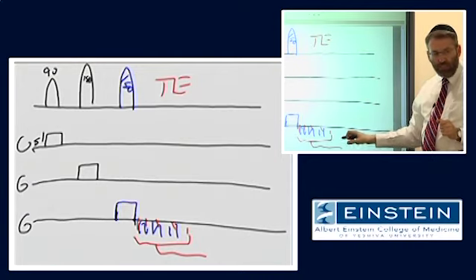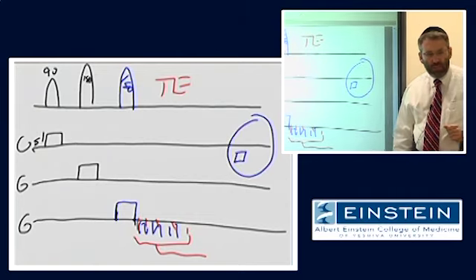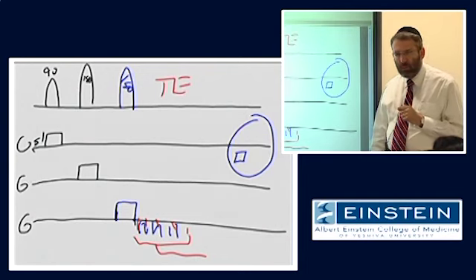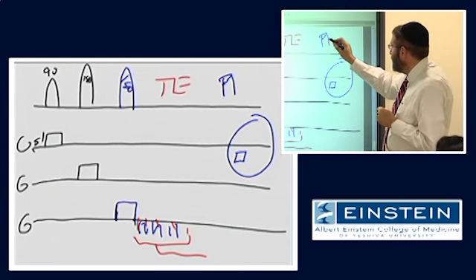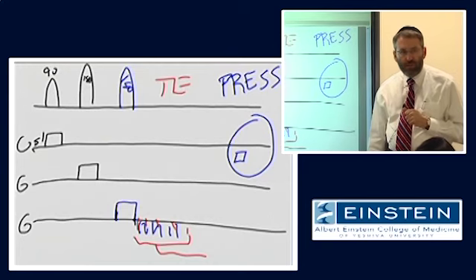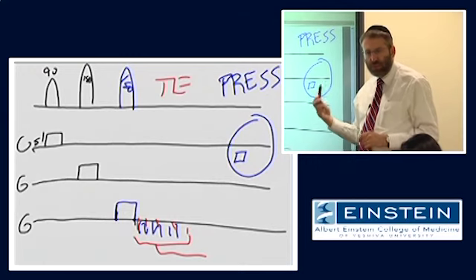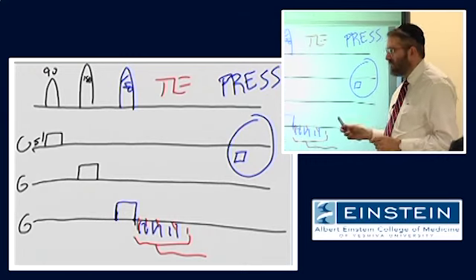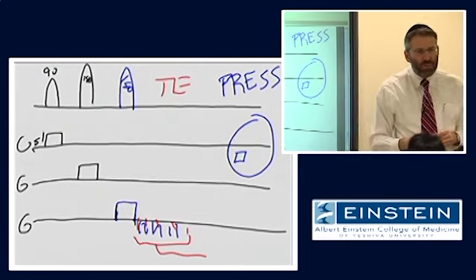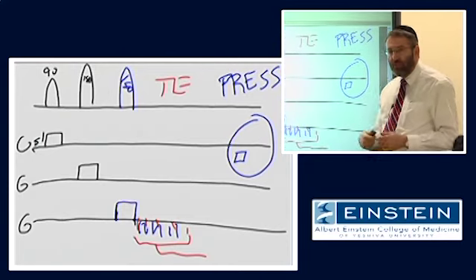So the signal that we sample at this point in time, we can now say comes from a specific location in the brain. Is that clear? This approach is called point-resolved spectroscopy, or PRESS. So if you ever see this abbreviation PRESS when you look at MRS, that's what it's referring to. So this allows us to look at a specific location, that allows us to look at signal at a proton spectrum, or whatever spectrum, from a specific location.